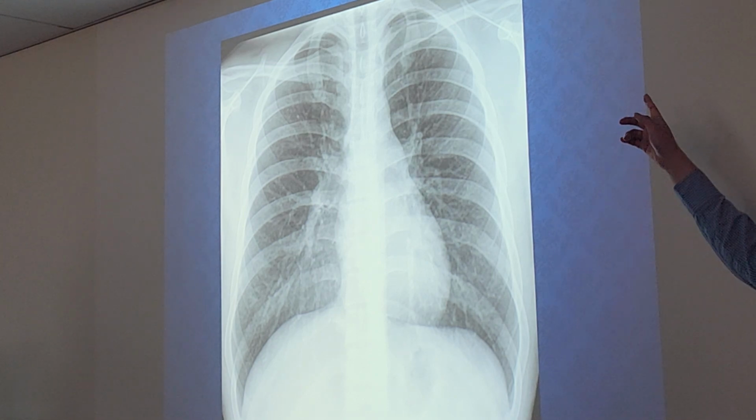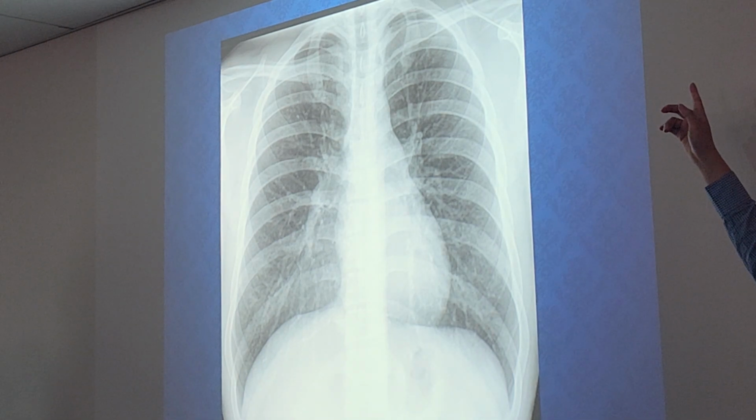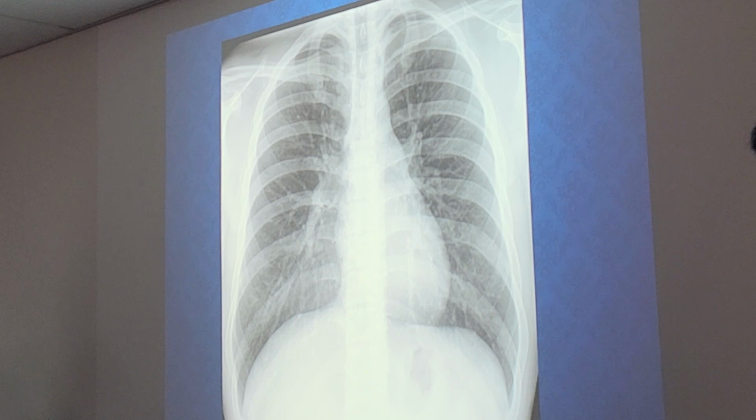So the L on the top being like that doesn't tell you if it's AP or PA. Good. But I saw from the ribs that it's PA, and then I see L there. That means that it's an image that has been flipped. Yes, that's a reasonable assumption. That is always bothering me. Why is it L?